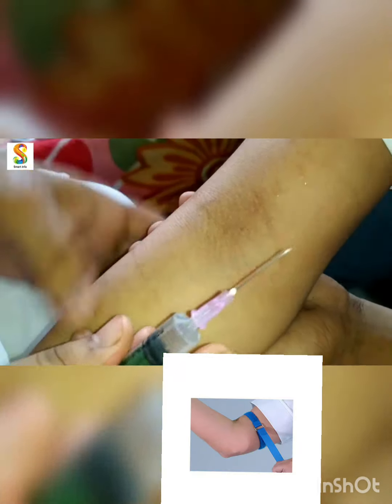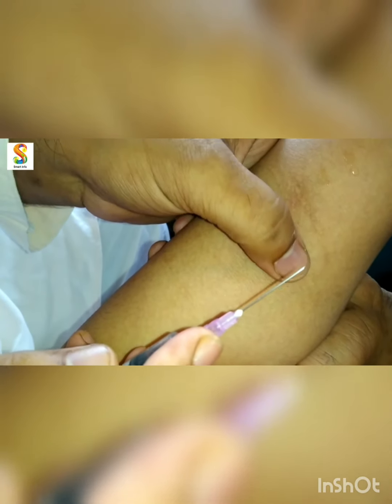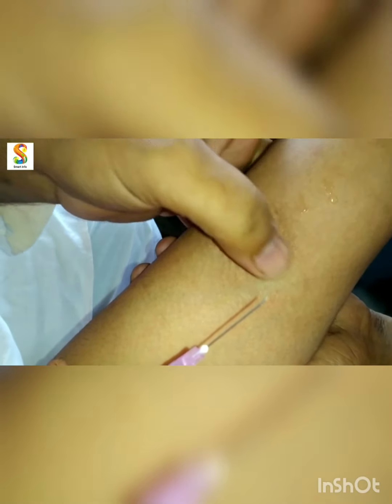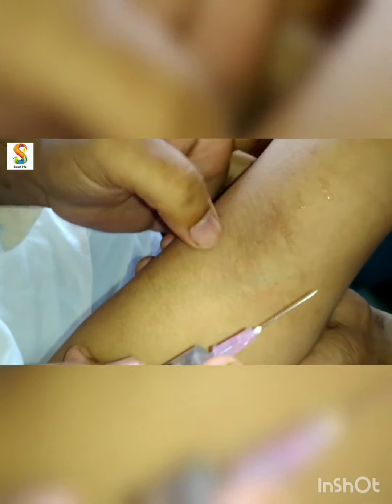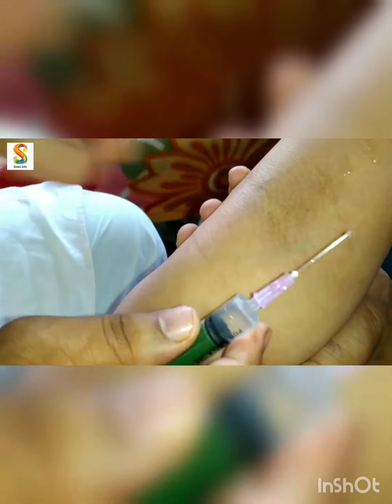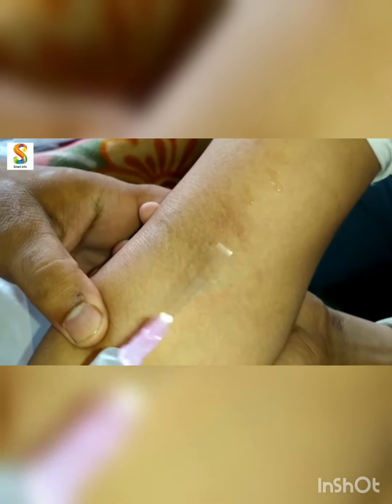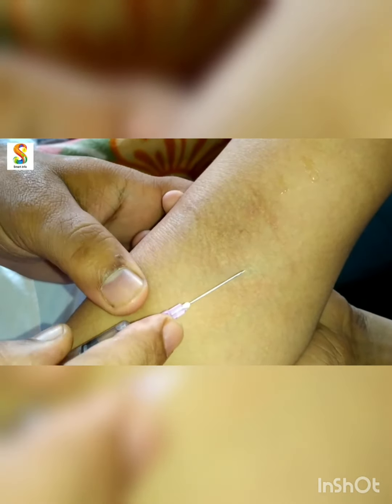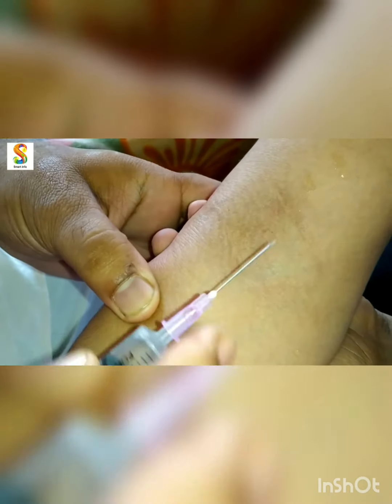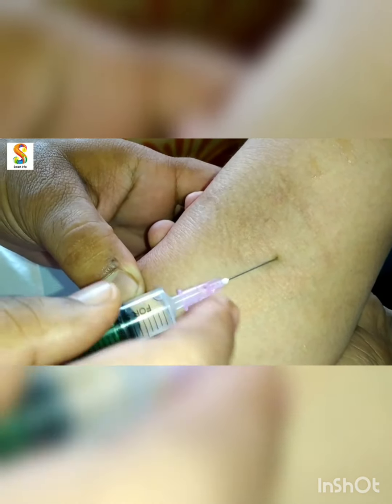Now all we need to do is insert the needle in a proper way into this vein, as you can see, into this vein. You can feel it like this. Now we need to insert this syringe into this vein. We need to hold the syringe at 25 degrees, stretch the skin, and then insert it at 25 degrees into the vein.